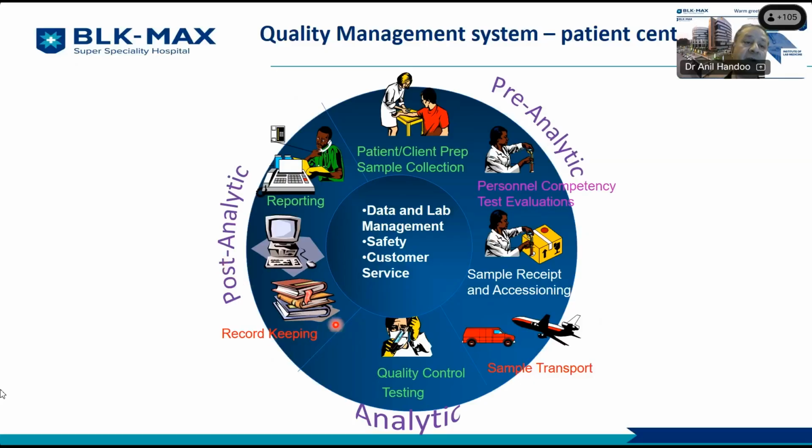And then finally, you have to keep the records and also report it out to the patient. While all this is happening, you also have to keep in mind that there is a lot of data and lab management. There is safety of the patient as well as the laboratory professionals. And then finally, there is service as well. So if you look at the entire gamut of these activities, they're all happening parallelly and need to be taken care of in a systematic manner.